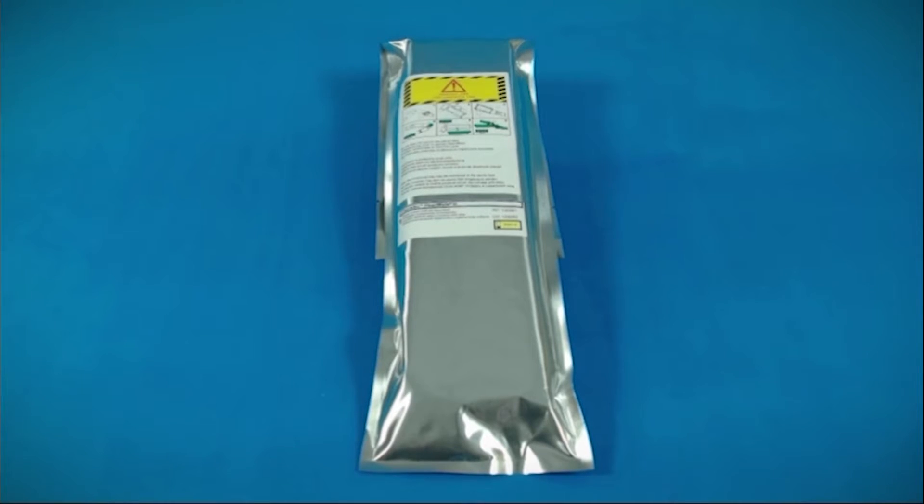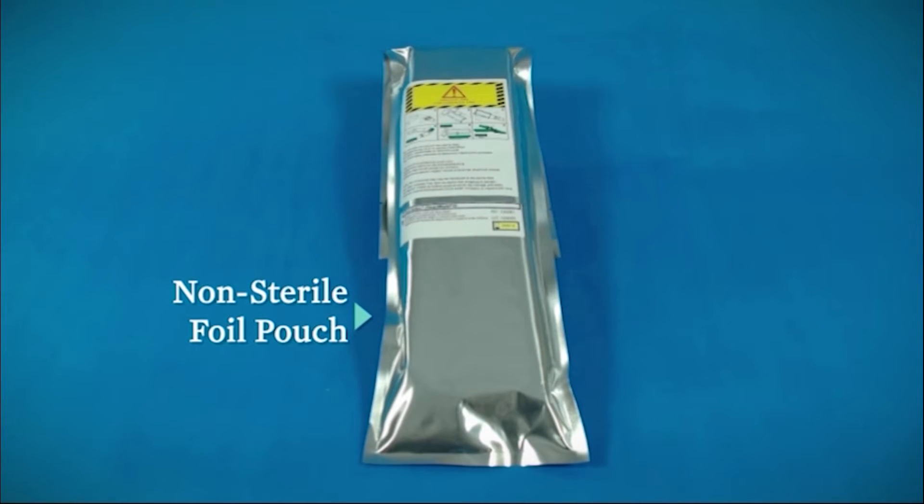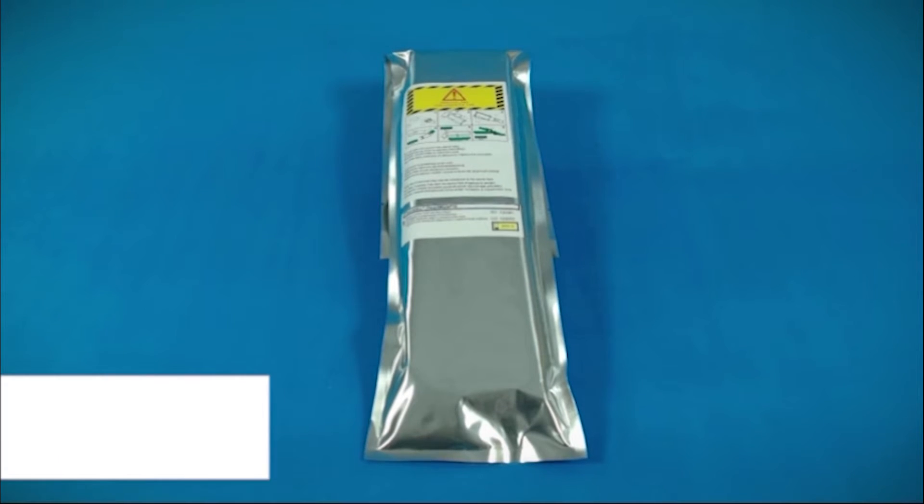The sealed outflow graft comes packaged in a non-sterile foil pouch. The pouch is only a protective cover and is not sterile; therefore, do not introduce it into the sterile field. Do not open it until it is ready to be used.